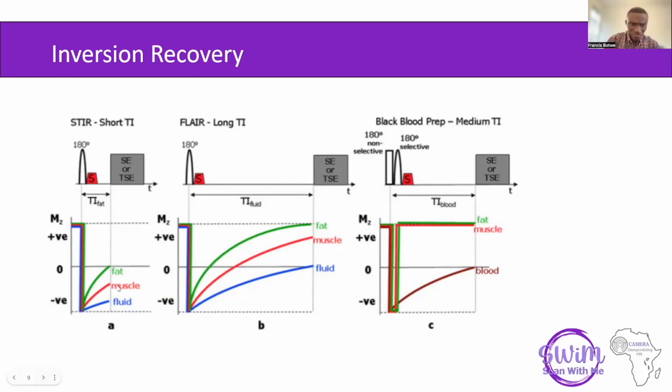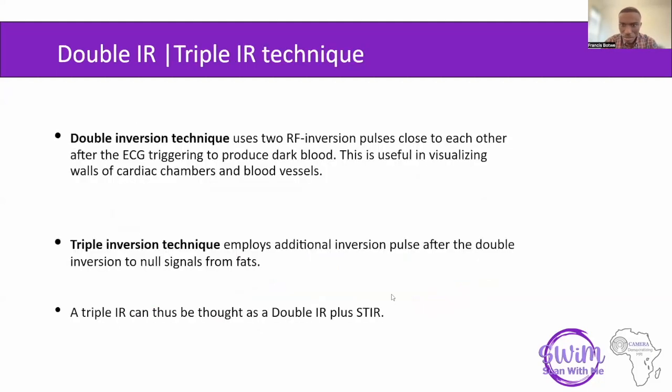So this variation in the inversion time and the null point will help us if we want to suppress a particular tissue. We will just put that particular inversion time in our parameters, and we can scan and try and suppress that part. Yeah, we can move on.